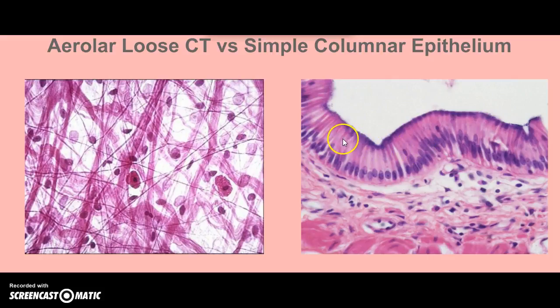This one you can't see them really well, but there's stuff up here called goblet cells, and the goblet cells make as well as secrete the mucus.